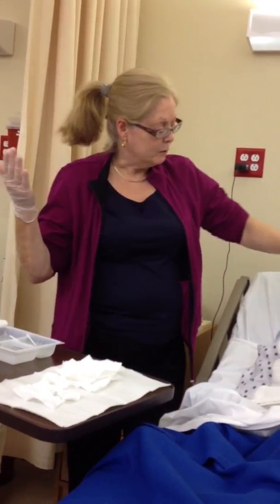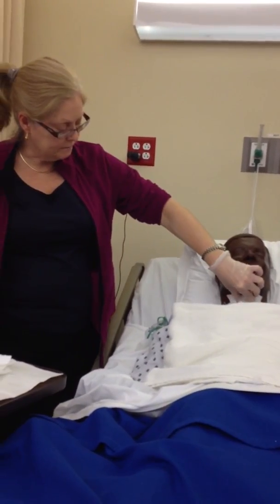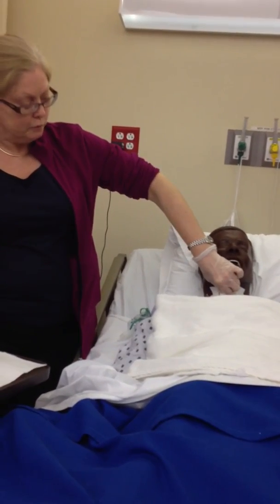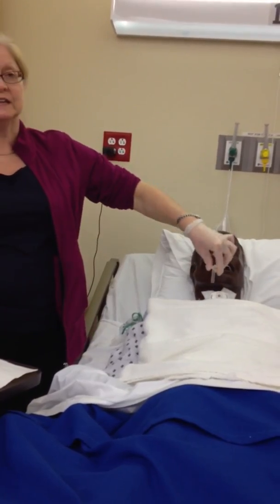So I'm going to go ahead and say, Mr. Jones, we're ready to start. I'm going to take your trach out. So kind of stabilize it and pull. And you want to pull downward toward the chest, because that's how it goes in naturally.